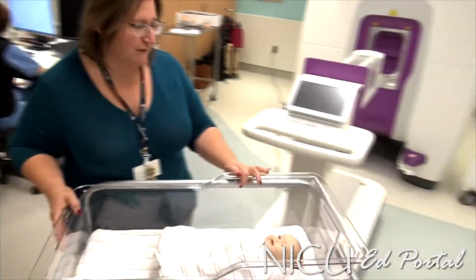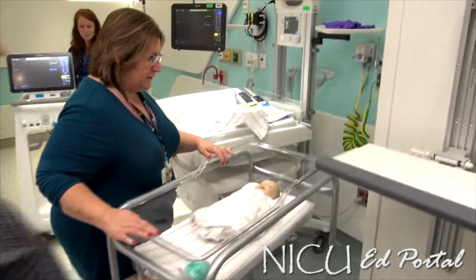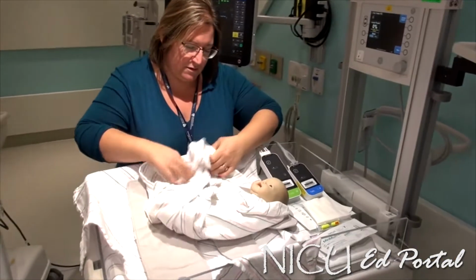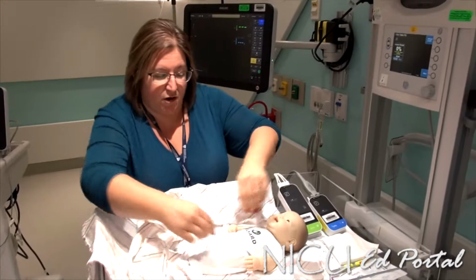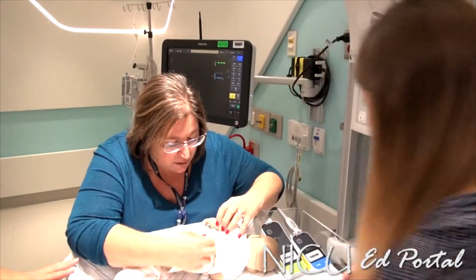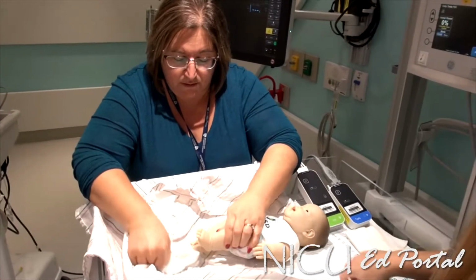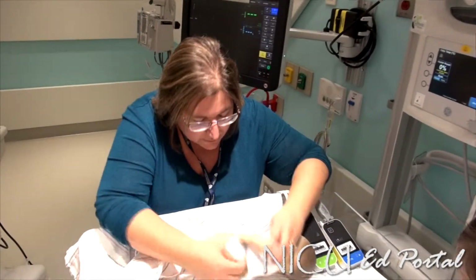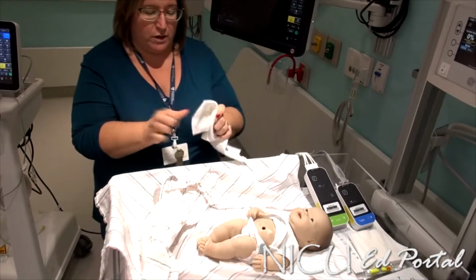Hi, Judy. Hello. I have Patrick Smith here for his research scan. So we're just going to wrap him and prepare him here. So what we need to do is we need to make sure that he has nothing on now. We're going to change his diaper and make sure that he has no metal on. I'm sure it's fine. Thanks. I'm just going to change him really quick.